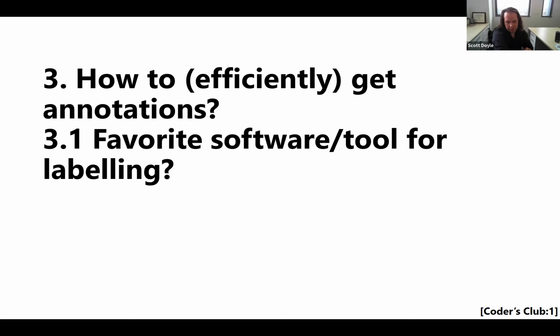So one thing about efficiency, to reiterate, is we let the classifier run as soon as we get a small batch of training samples, and then we use that to drive the discussion to make things more efficient. The annotators themselves are trained by our clinical collaborators, so they have residents and fellows and med students that they train.